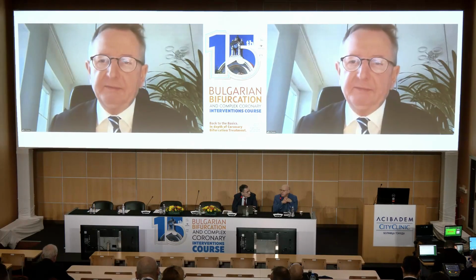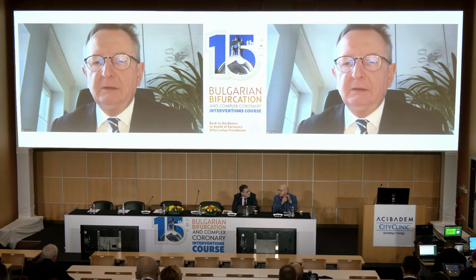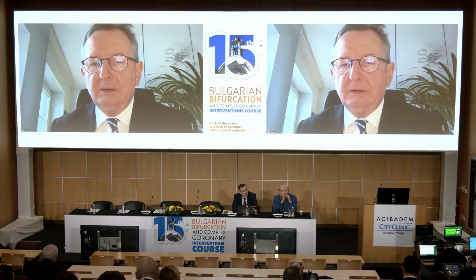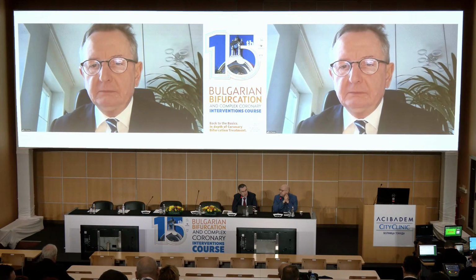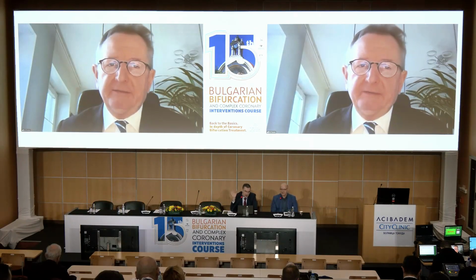It's a matter of technique, really, because the main issue of burr entrapment is that the burr stops rotating. And if it stops rotating, it doesn't matter whether you have diamonds on the front or on the back of the burr. So you should do it slowly, and you should have patience just to overcome, make some space, wait, and that's what I think. What I personally saw is that the operator was too fast. Exactly. Patience is very important, number one. Don't rush.